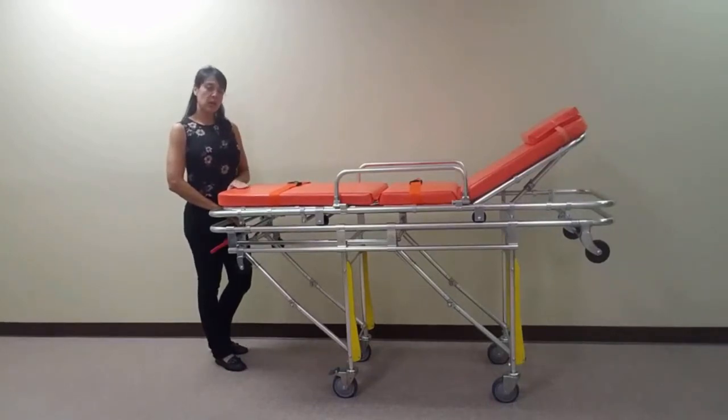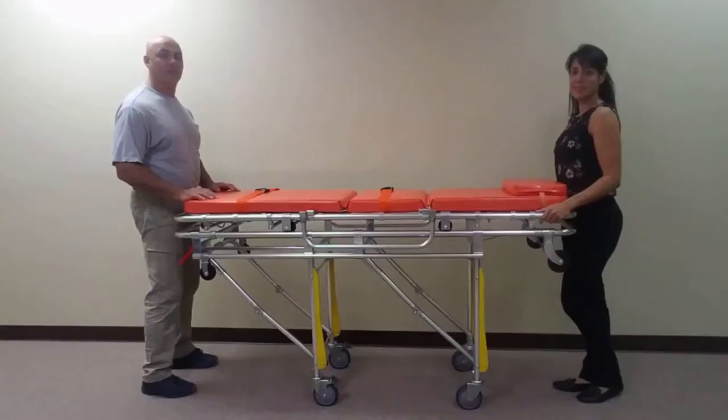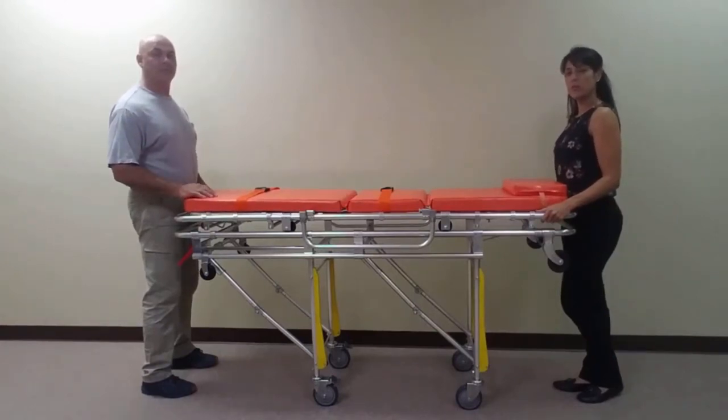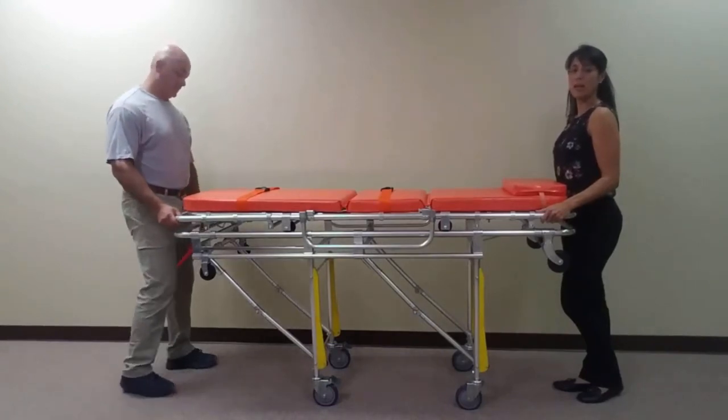To replace the cradle, set the cradle back on the stretcher and push down on the release mechanism to allow the cradle to be set back into place. To remove the cradle during demonstration, push down on the red lever at the foot end and lift the cradle off the stretcher's frame. To replace it, set the cradle back down and push down on the red lever to lock it back into place.